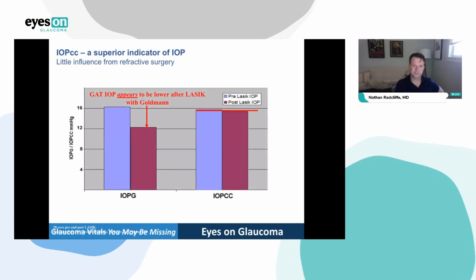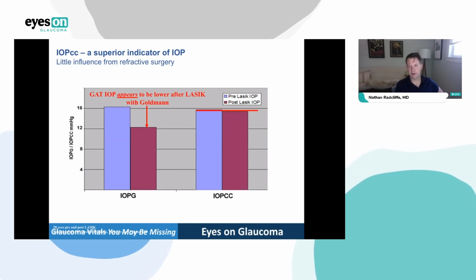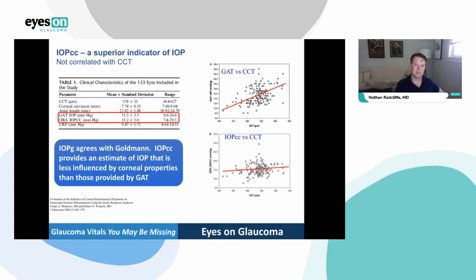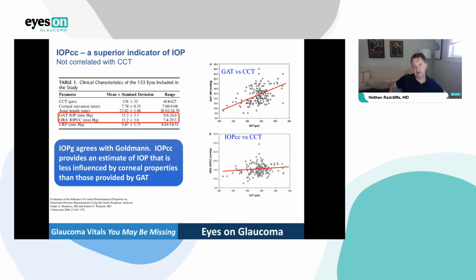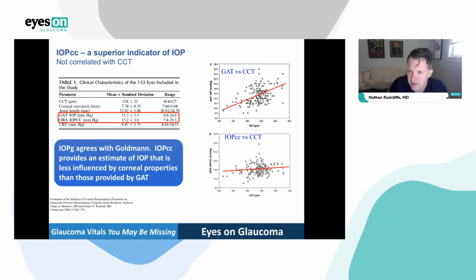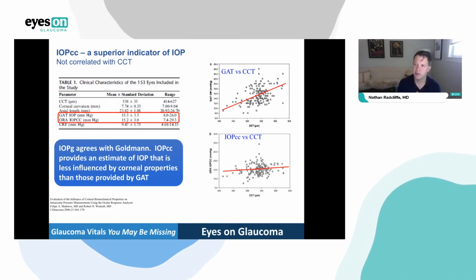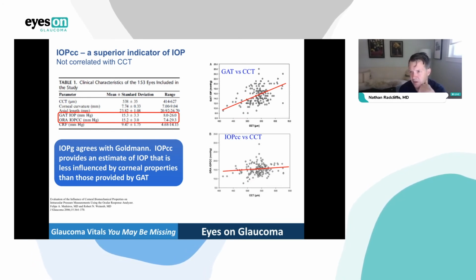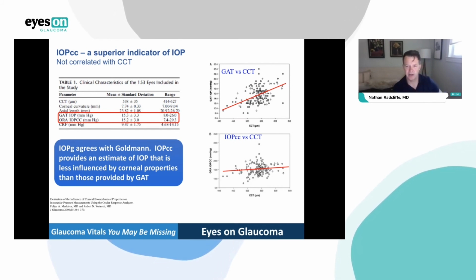And here's the data. Very simple study showing that the Goldmann pressure drops after LASIK, but that the IOPcc doesn't, in this group of 28 eyes pre and post LASIK. Fairly straightforward. In a population of patients where you're measuring corneal thickness, you'll see that you tend to have higher pressure readings in thick corneas, but it's tough to know on an individual basis. When you use the corneal compensated IOP measurement, and this is going to come up when we talk about CATs in a moment, you are less influenced by corneal thickness.